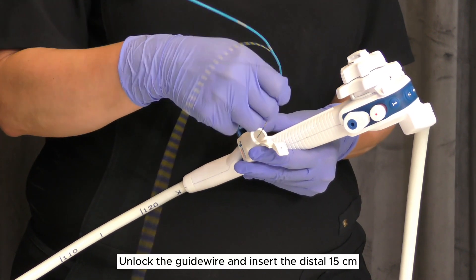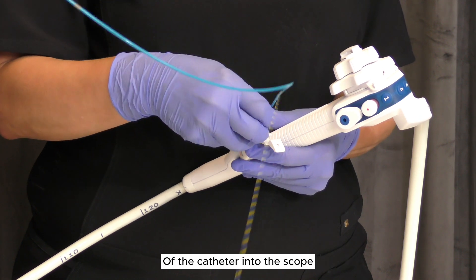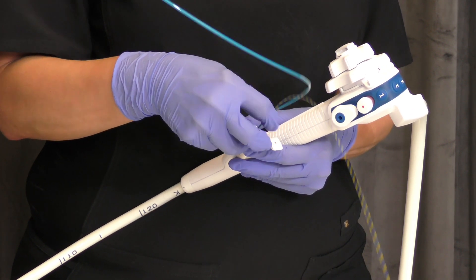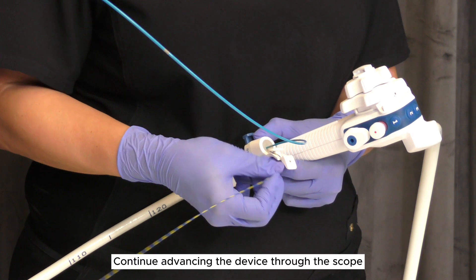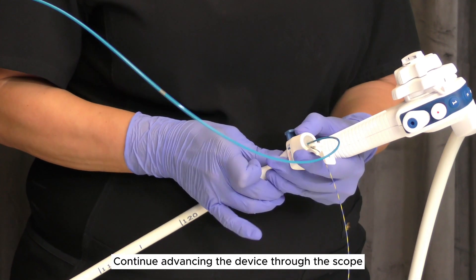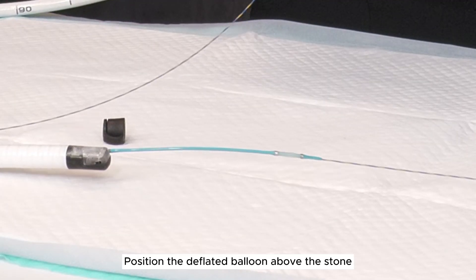Unlock the guide wire and insert the distal 15 centimeters of the catheter into the scope. Relock the guide wire and continue advancing the device through the scope until the distal portion of the catheter exits the scope.